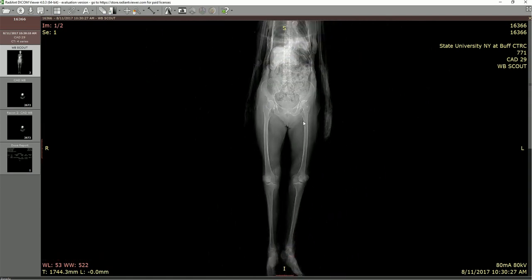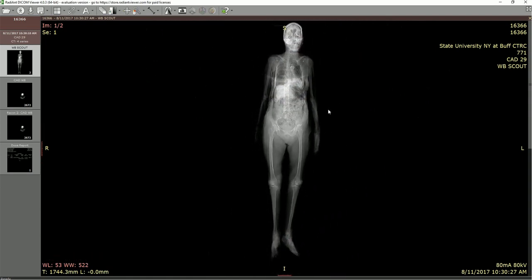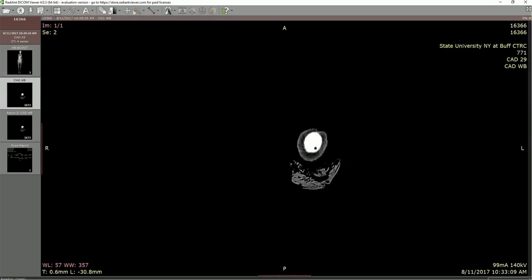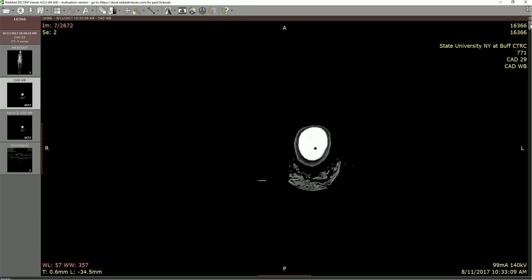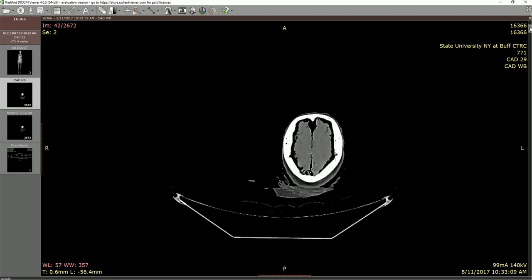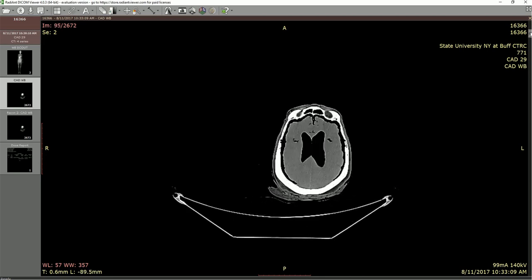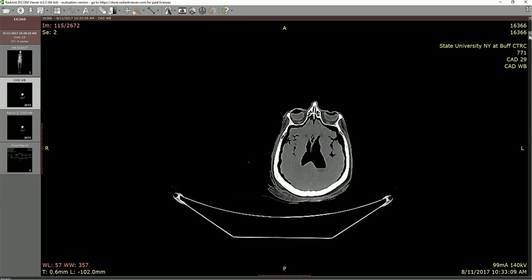The next thing we want to do is take a look at some of the CT data. We'll start with an axial view, which always starts at the top of the head, so we're going to scan through fairly quickly since we haven't studied brain tissue yet. Interestingly, when we get to brain extraction with this particular cadaver, I'm noticing the left and right ventricles — the first and second ventricles — show significant enlargement. It looks like we'll have some brain pathology: deterioration, hydrocephaly, that sort of thing. Just something to keep in mind for that group when we open the cranial cavity.